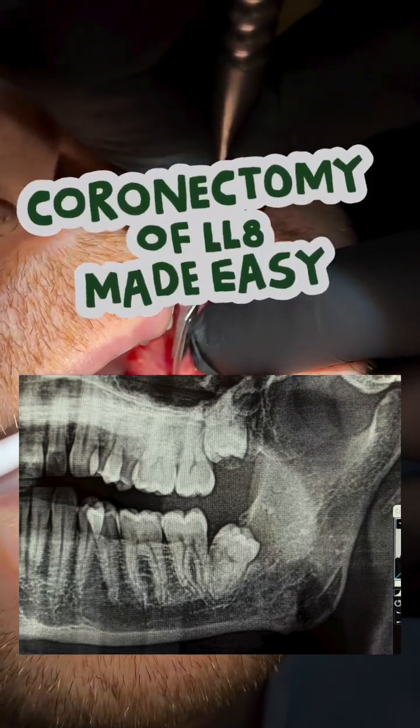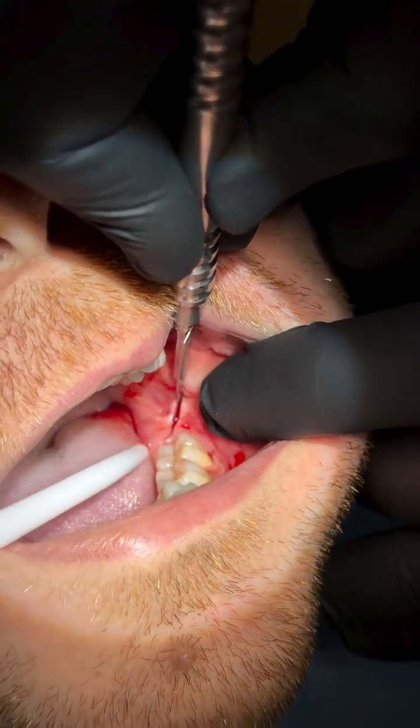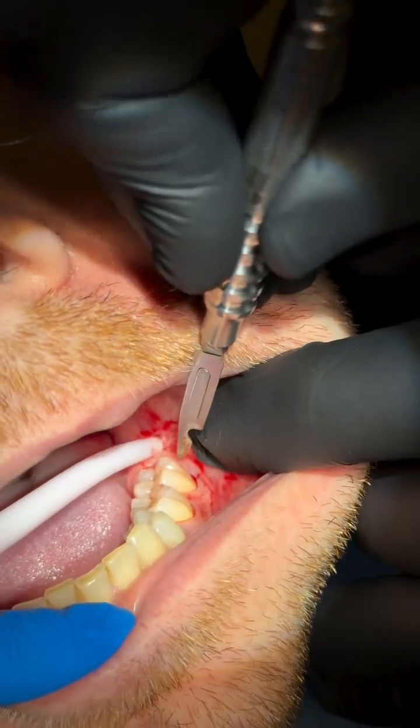So here I'm going to show you step-by-step coronectomy of the distal angular impacted lower left 8 and enucleation of the associated cyst.